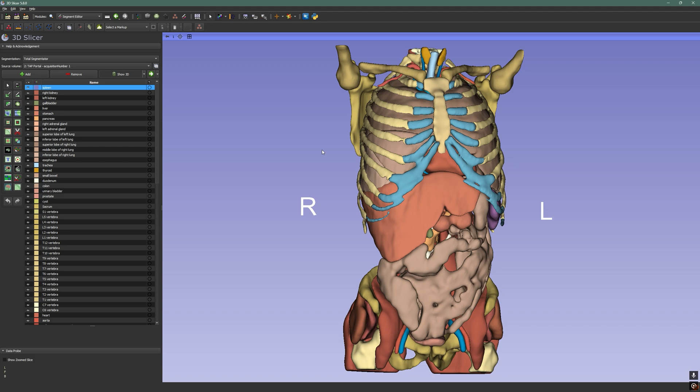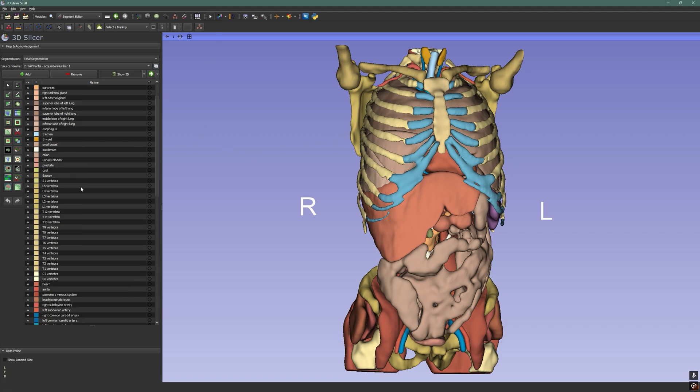However, since there is a large number of segments, it may be useful to create additional segmentations to classify them — for example, abdomen, thorax, bones and muscles. So I'm going to show you how to do this.